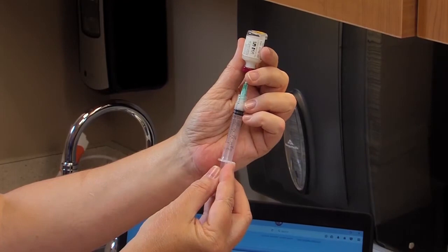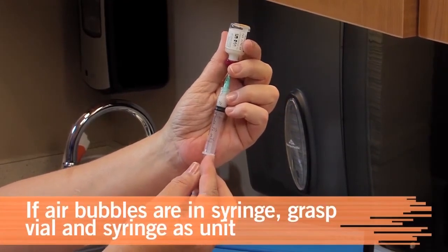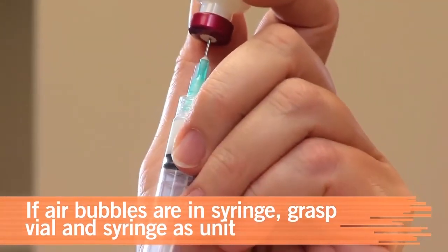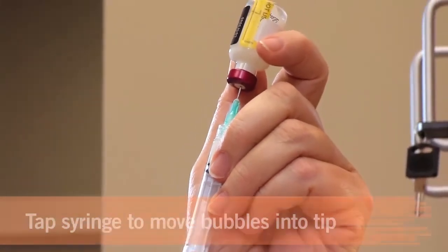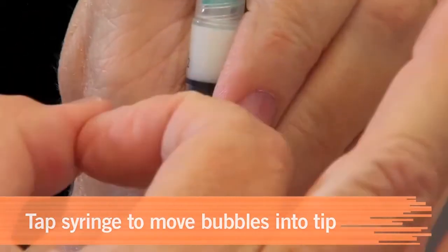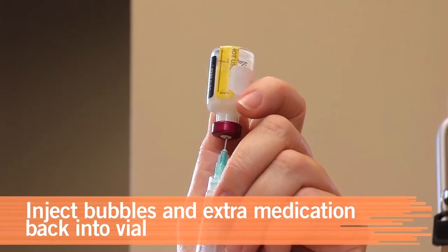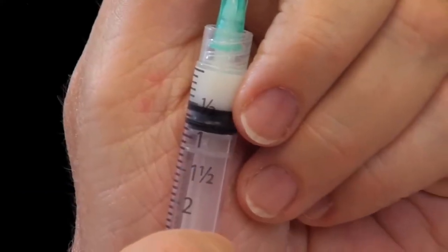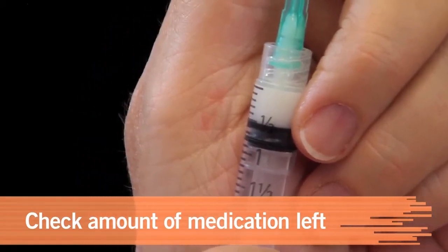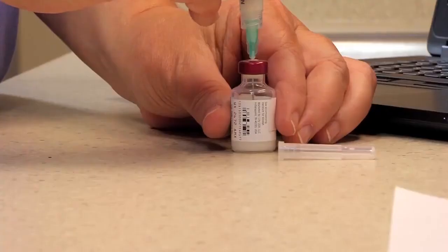While the needle is still in the vial, check for air bubbles in the syringe. If you see any air bubbles, move the hand with which you're holding the vial down to hold the syringe as well. With your free hand, tap the syringe until the air bubbles float into the tip of the syringe. Inject any air bubbles and extra medication back into the vial. Still holding the syringe and vial at eye level, make sure the amount of medication in the syringe unit is still accurate. This confirms that the right dose has been drawn up.